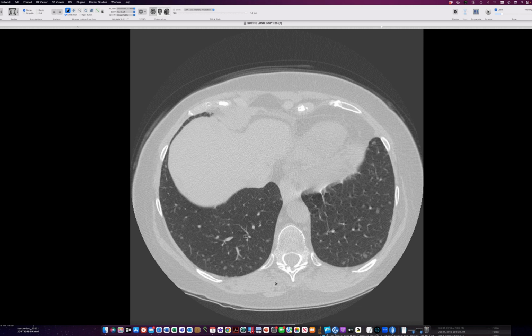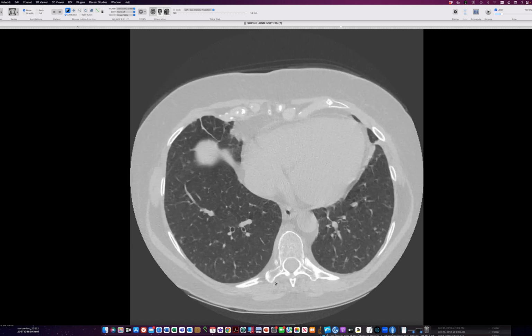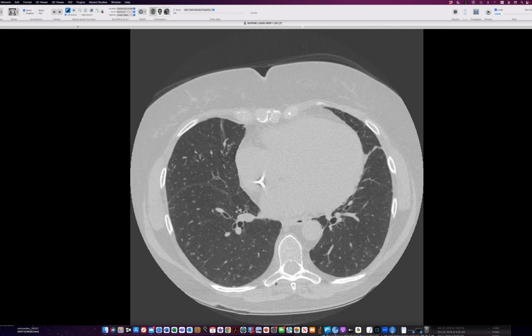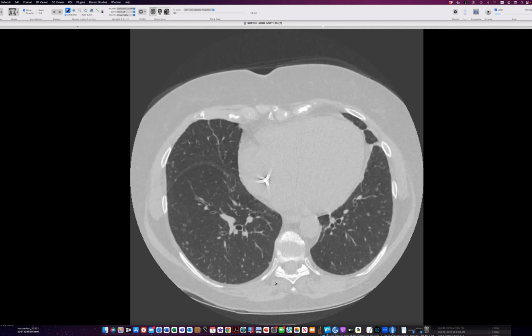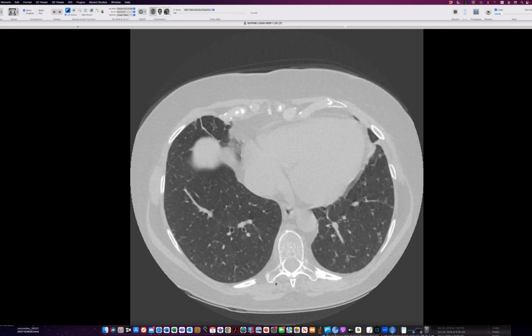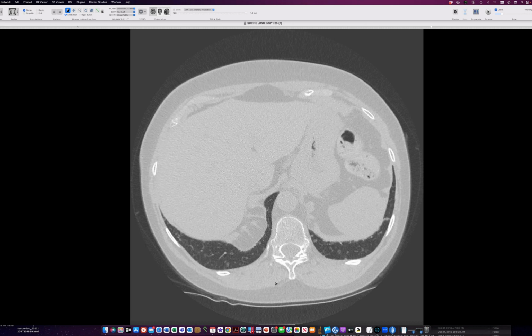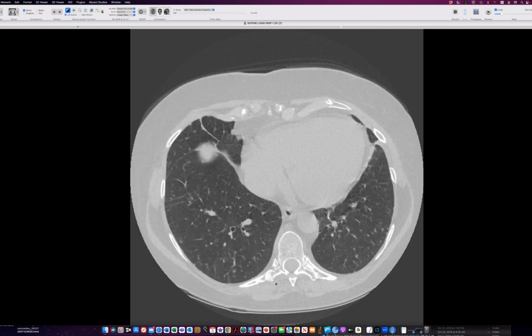Have you guys seen this profusion before, or is this kind of on the high end of number of nodules? What do you think? I've seen this. It's on the high end a bit. Yeah, it's prominent, but I've seen ones with this many and ones with a lot less. And as far as I could tell, going back to 2020, when I looked through all the septal lines, these nodules haven't really gone anywhere. Yeah, they don't change in that period of time, right?